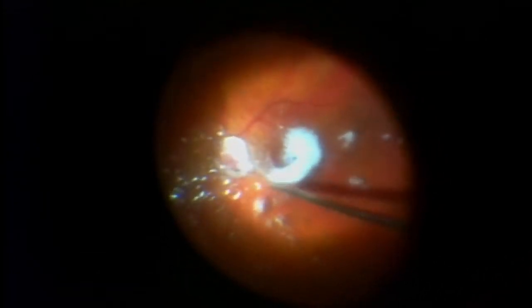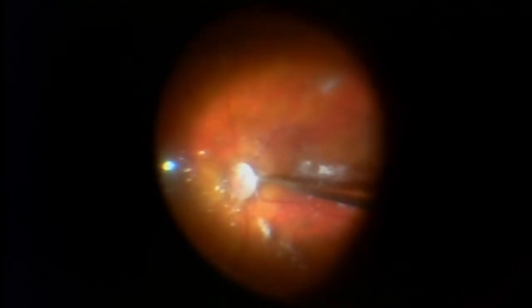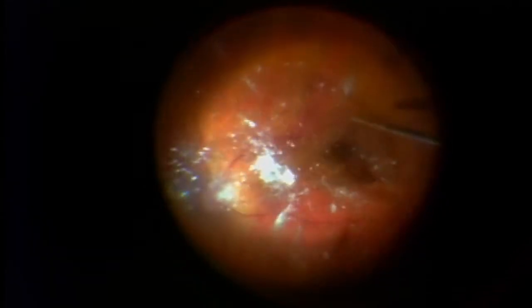What I normally do is remove excess Kenalog, which is kind of what I'm doing here. Then at the same time, I'm going to pull up on the posterior part of the vitreous. Now watch this — it's going to come up pretty quickly. See how it kind of comes up towards the microscope, towards the anterior vitreous. Now that's the posterior vitreous being lifted off the posterior retina.